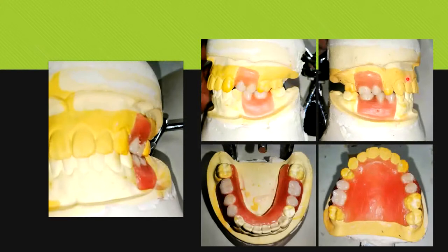After the wax up and tooth setup is completed, this is more or less the picture that is going to be on your partial denture arches. You will notice that all of the wax patterns are completed. But remember, this is not the final tooth setup. If you haven't made any wrought wire clasps for these acrylic partial dentures, you will be required to place those metal stainless steel wires or clasps on the adjacent abutment teeth before you finalize the process.